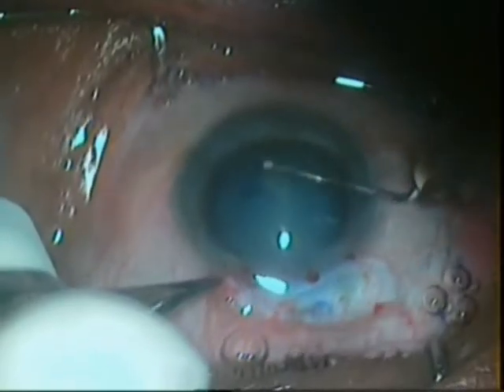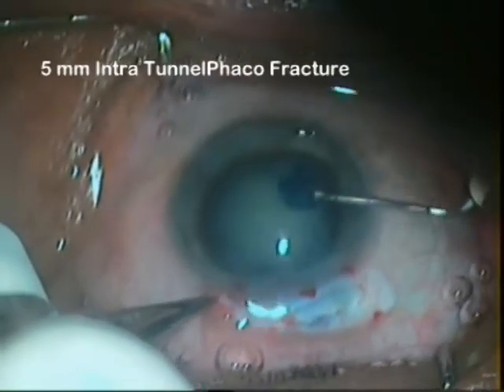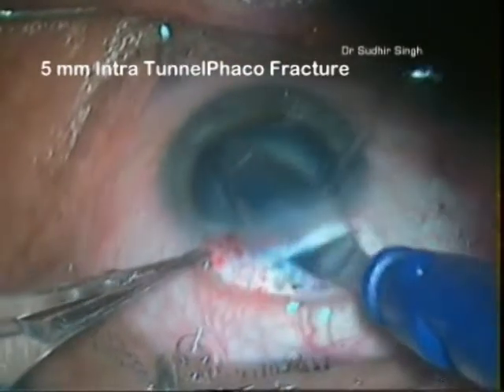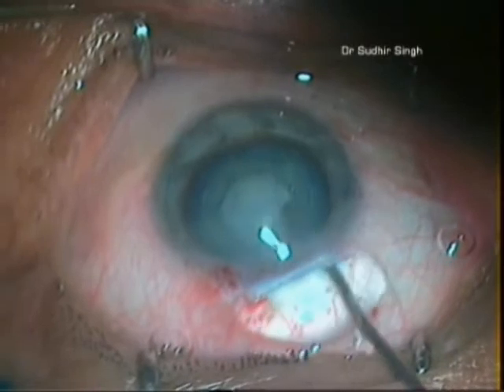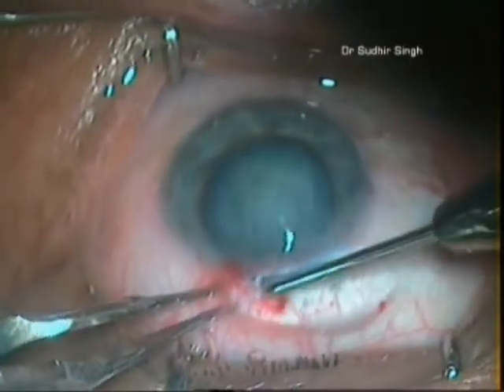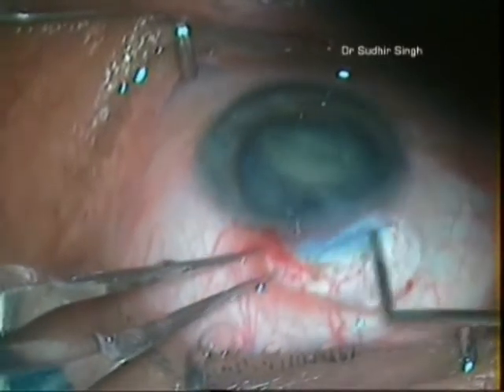We are going to demonstrate 5 mm intratunnel phacofracture in white cataract. Capsulorhexis is done and the section enlarged to 5 mm. The nucleus is prolapsed into the anterior chamber with the Sinskey hook.